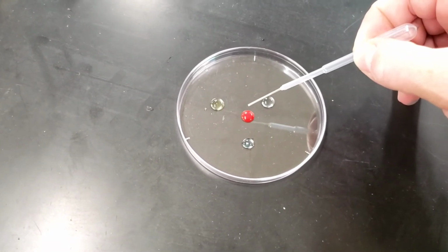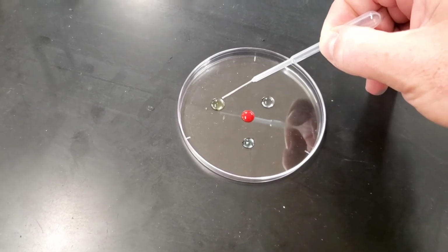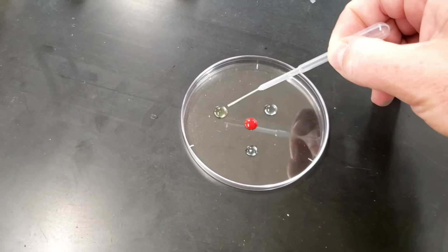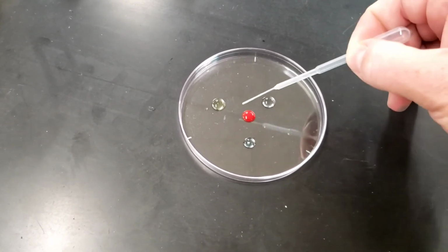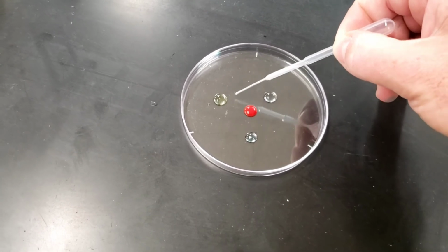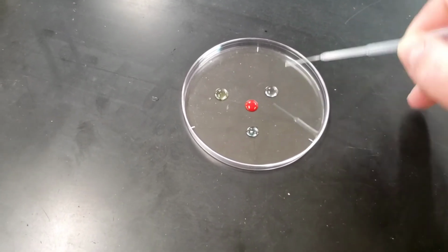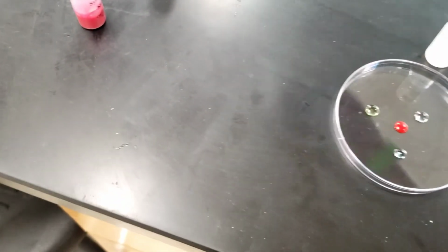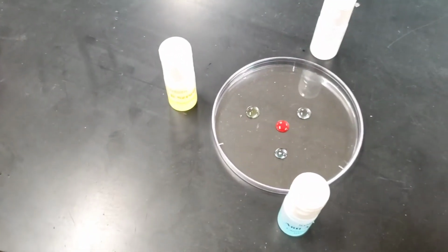So if I got a white band to form between the blood type and the anti-B serum, then that would tell me that this must be at least a B blood type, if that's the only place it formed. So in between those, if I got a white band to form, then it is a B negative blood type. Let me show you the bottles.